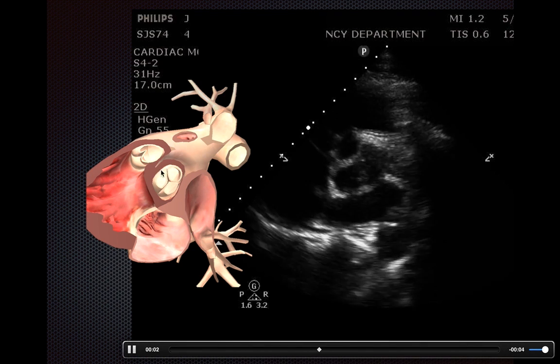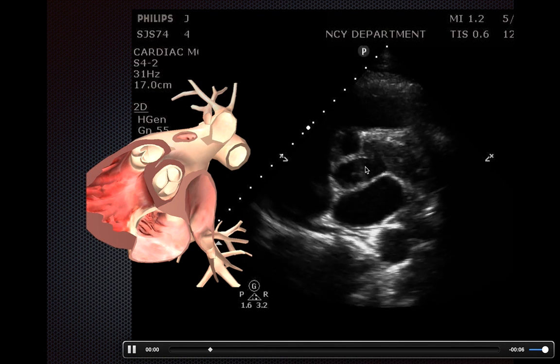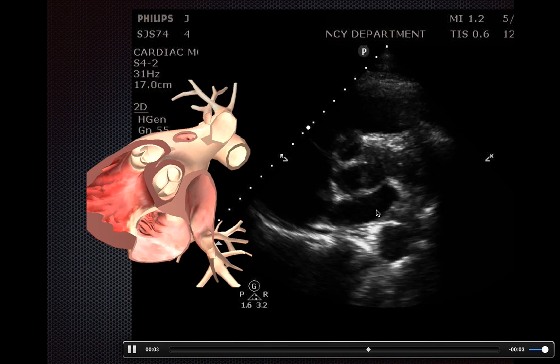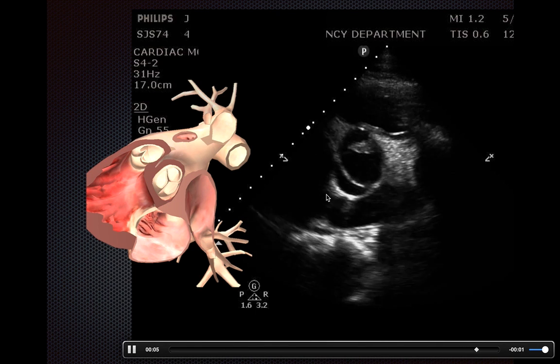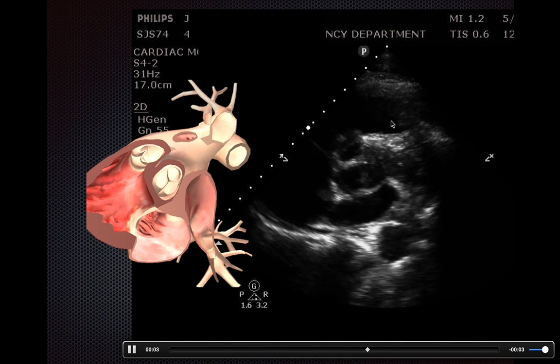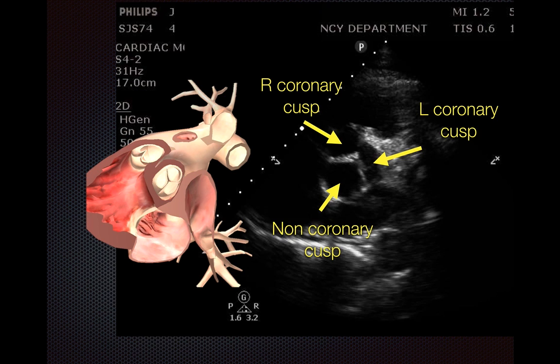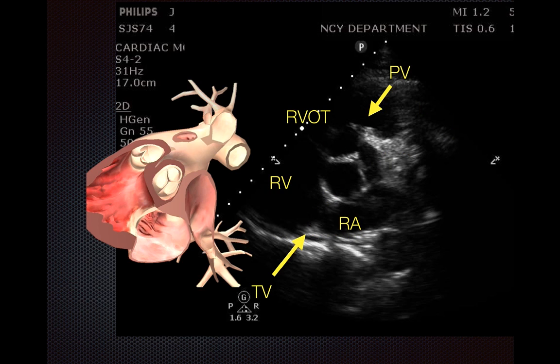As you scroll up to look at the tri-leaflet aortic valve — this is the Mercedes-Benz sign — you have your right atrium, tricuspid valve, and right ventricle going through. You can also see a hint of the pulmonic valve. Anatomically you're looking at the three leaflets of the aortic valve, along with other structures that may be important for pathologies you might look for, such as an embolus.